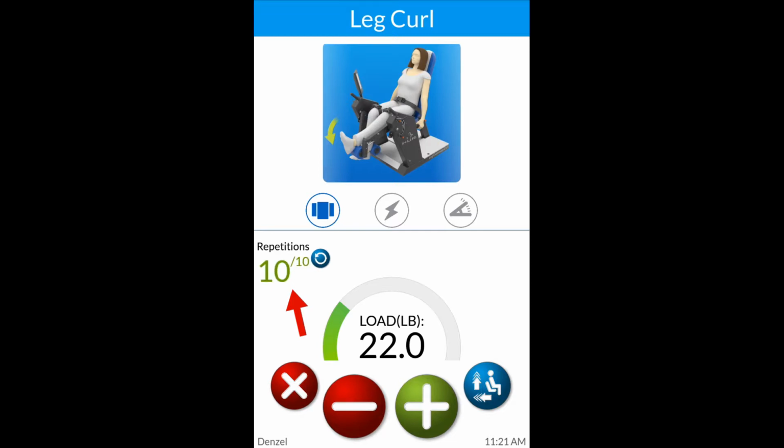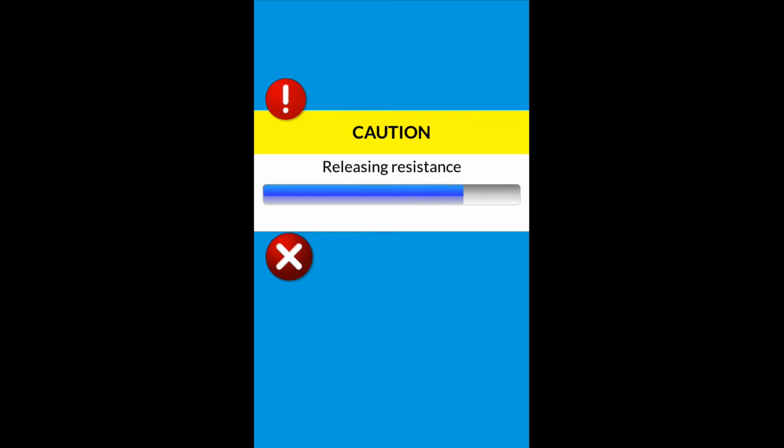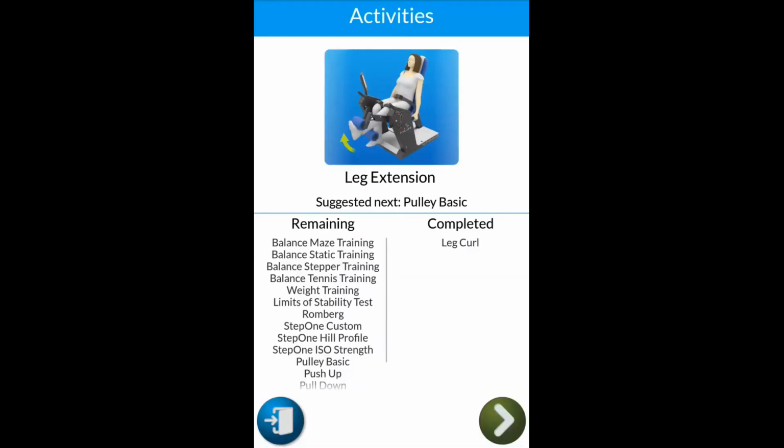After a few seconds, the air will release and the resistance will go back to 0. You can, however, keep going beyond the target number of reps after you hear the chime, before the air is released. Oftentimes, the repetition condition is set to 1 or 2 extra reps as the basis for automatic increases in resistance to take place. For more information about setting the condition for automatic increases based on overperformance, please see the How to Create, Edit, Copy, and Delete Training Templates video that talks about this in detail.